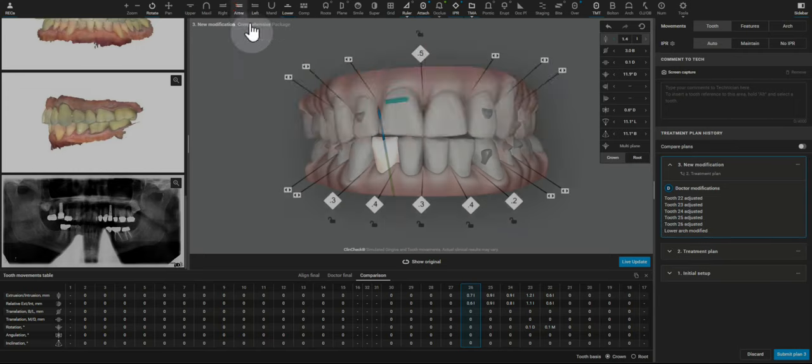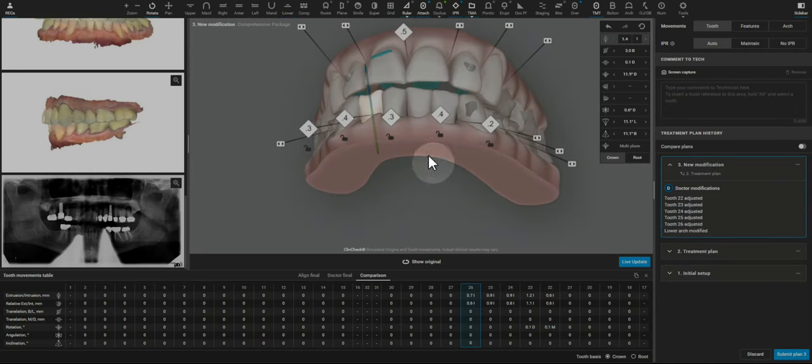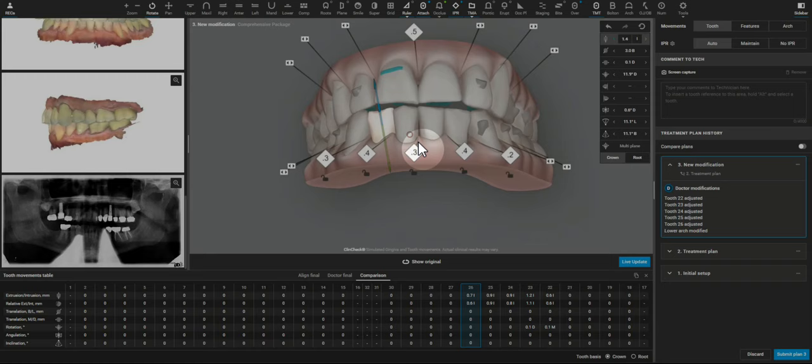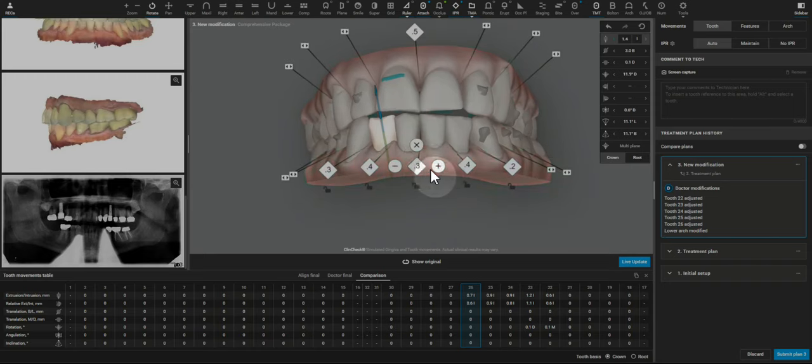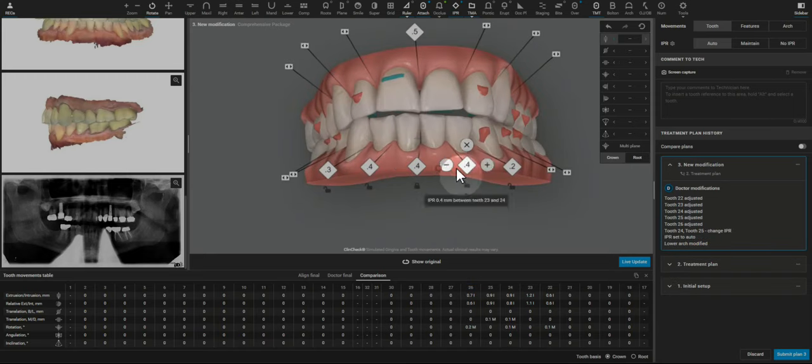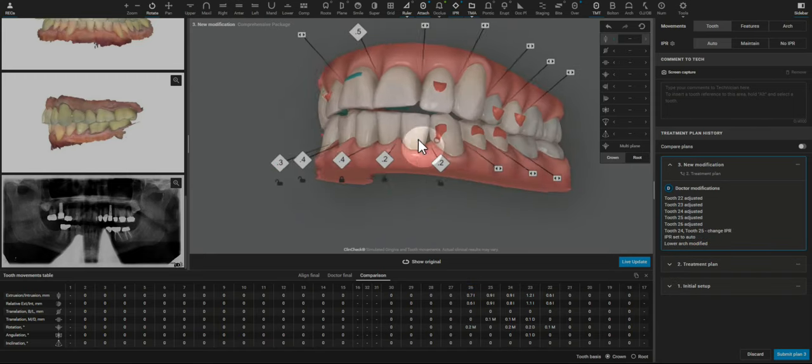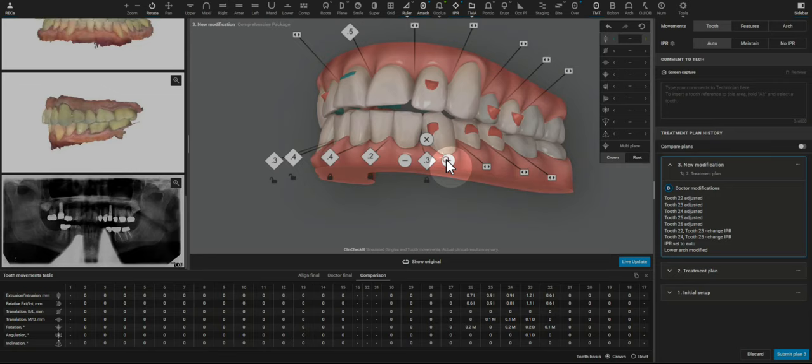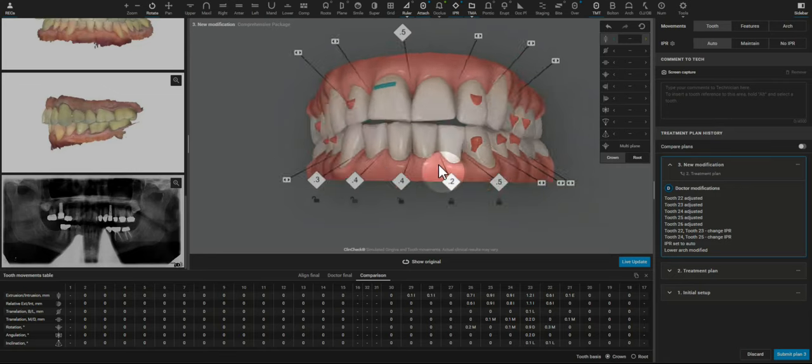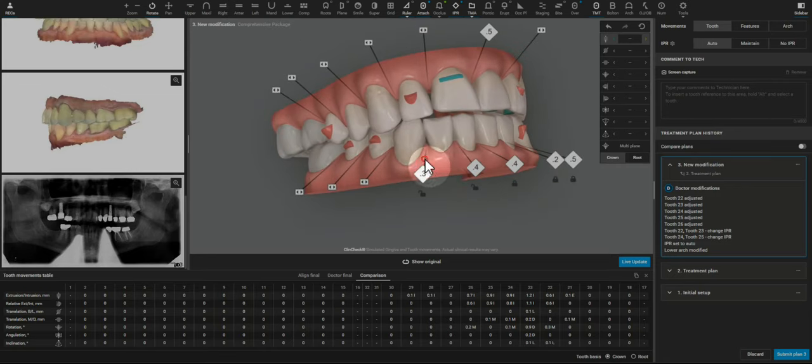So with that, we can see more interoclusal space on the ClinCheck. That makes me feel much better that we wouldn't finish with an anterior interference, aka a posterior open bite.